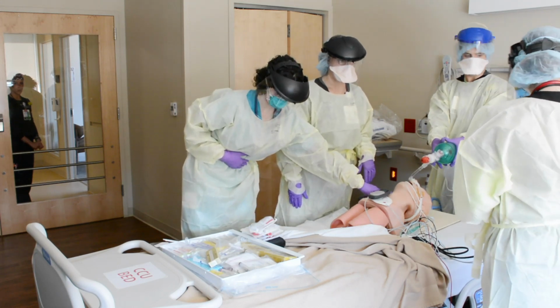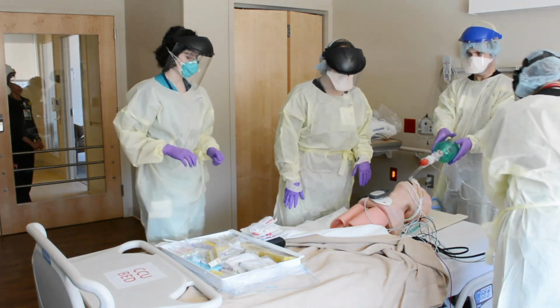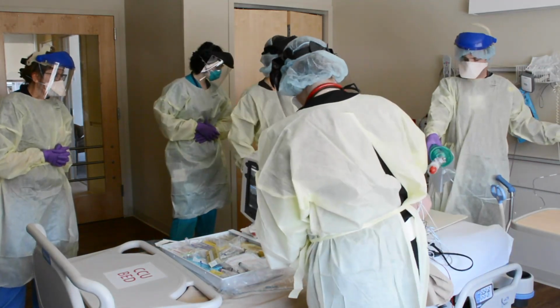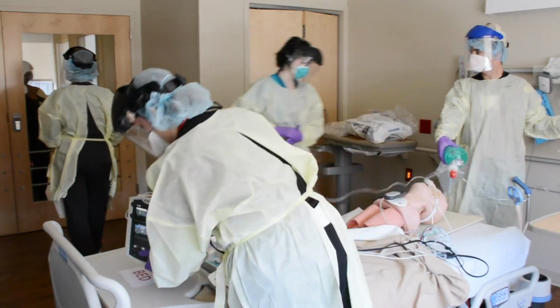The clinical administrator has been outside of the room and will act as a liaison to CCU and to the CCU attending. They will not be part of the in-room code team. Person on the outside, can we get an oxygen tank, please?